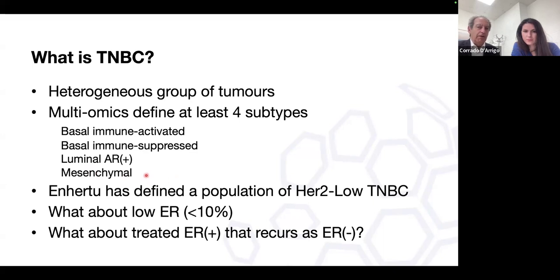But remember, it is possible that these subtypes may respond differently. And also they have different proportions of PD-L1 positive cases associated with them. So keep that in consideration. Currently, we are not subclassifying this tumor.